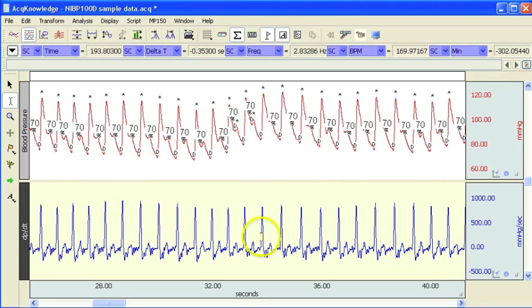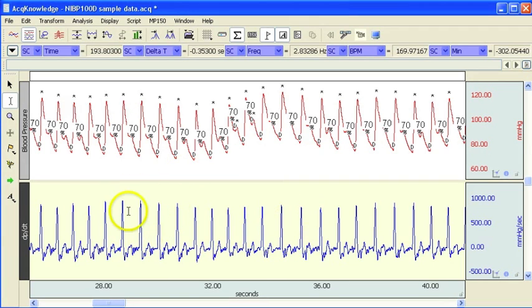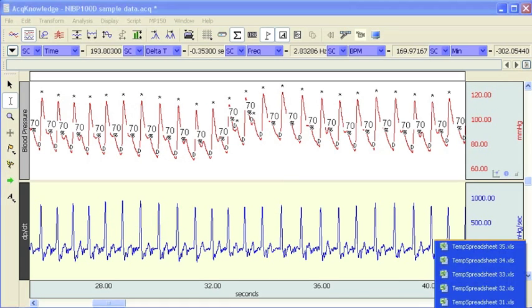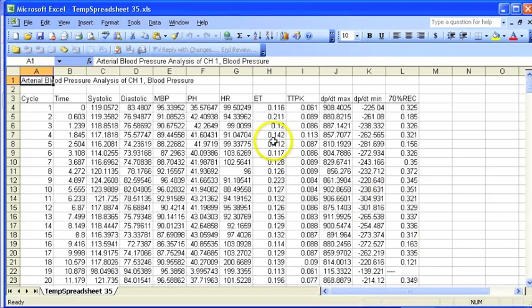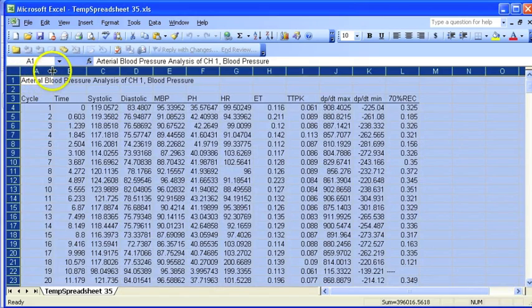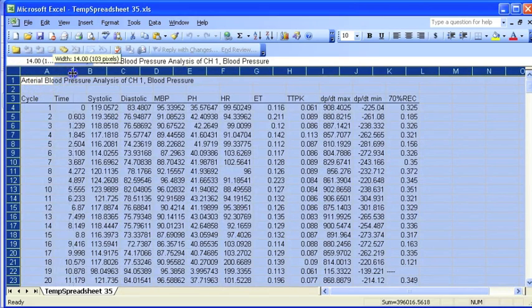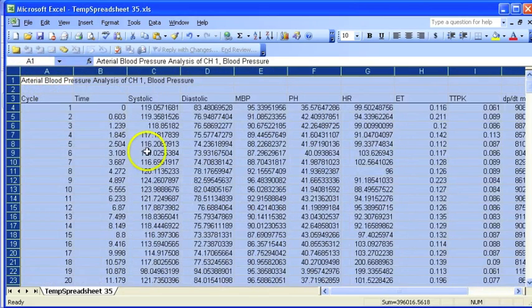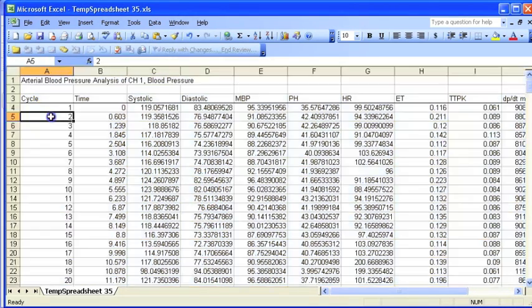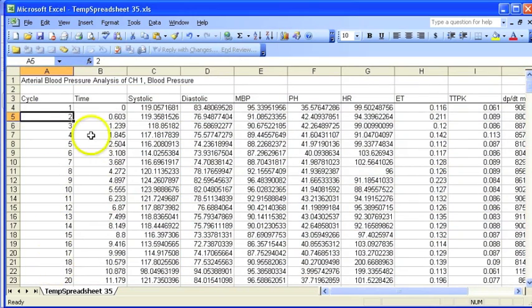Down below the software has also calculated the first derivative, DPDT, and that value is displayed as a new channel. If I come over to my spreadsheet, if I open this up a little bit, you can see that we've got the cycle number and everything's in columns.